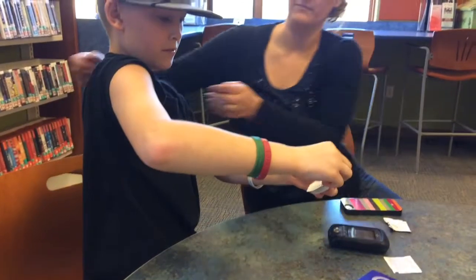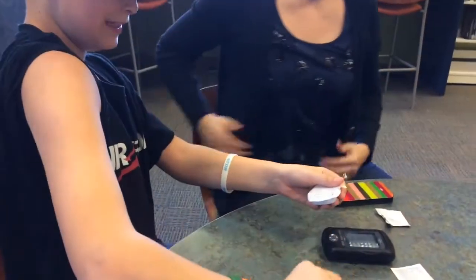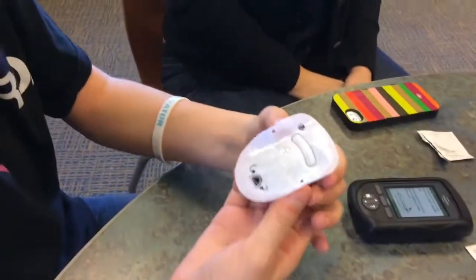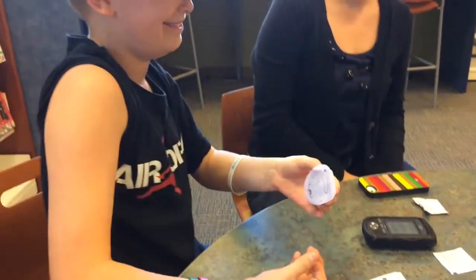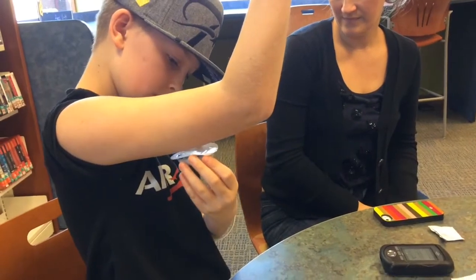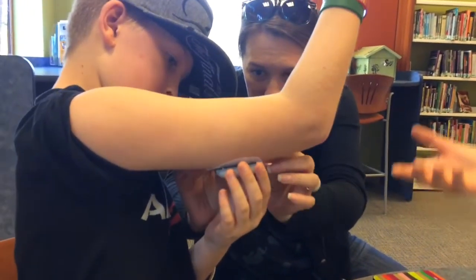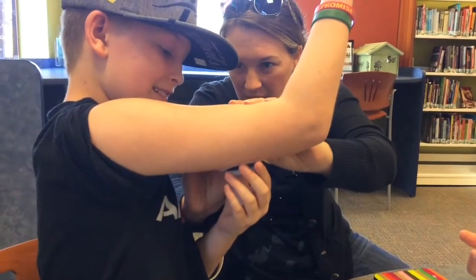You have to just be real careful you don't drop it — it goes down into the side. Good job, sweetie. And then without touching the tape, you hold the side of the pod real tight, and then towards your mom. Good job. It doesn't matter what direction it goes — the cannula can face you or not face you — and he's just going to directly stick it right on the skin. Right in that area. Good job. And you just stick it right on there.